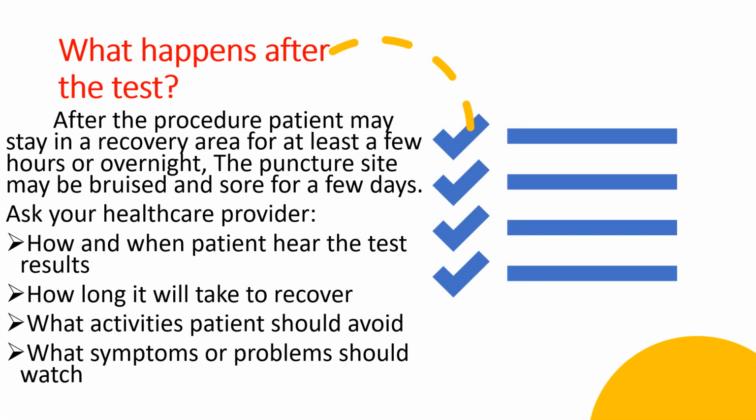So what happens after the test? After the test, the patient may stay in a recovery area at least a few hours or overnight, and we will be keeping a sandbag to give compression. Sometimes the patient may be having some bruising at the puncture site for a few days. That is common, and the patient should avoid heavy activities for a few days.